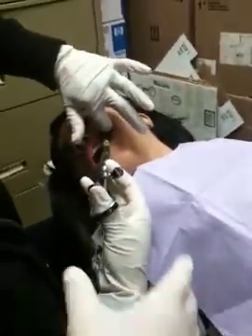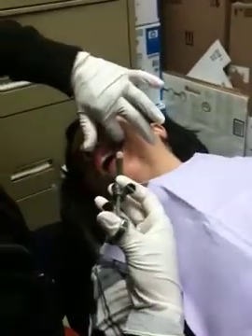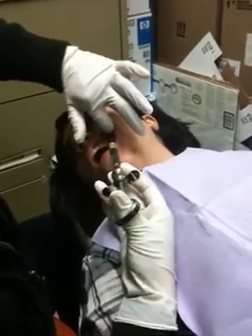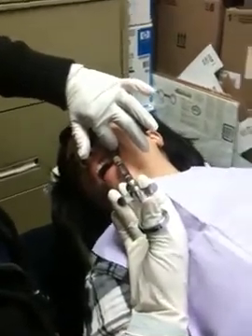Do you have to come more? More. You have to leverage it out. Like that? Mm-hmm. It depends on the long axis of the tooth. Remember, you're following the long axis of the tooth. So right there. Yeah. See? What a difference.